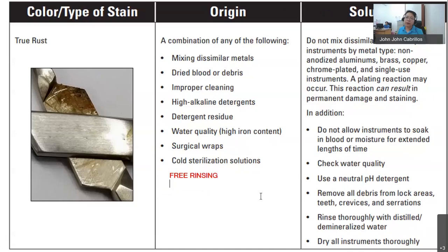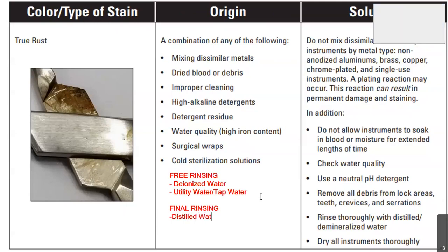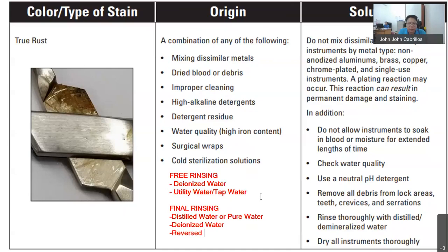For the free rinsing, the first option is deionized water. The second, if you don't have it, the term they use is utility water or tap water. For your final rinsing, the first option is distilled water or pure water, deionized water, and reverse osmosis water.